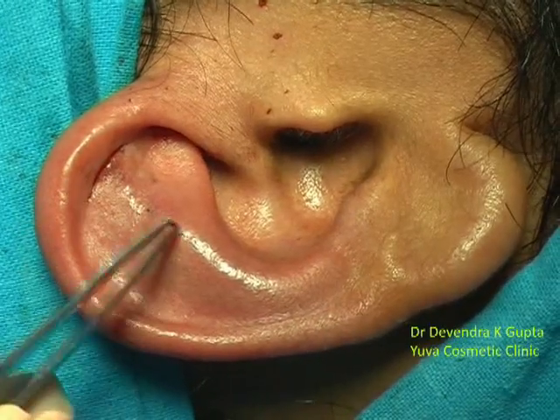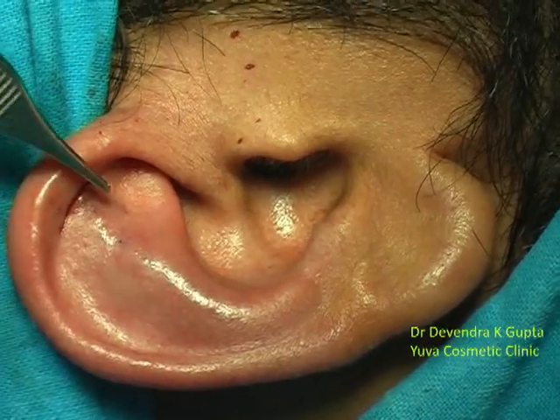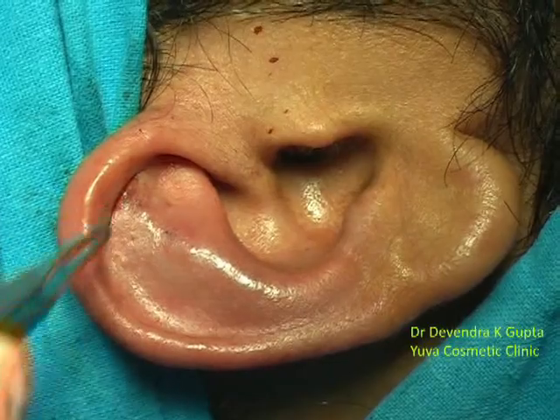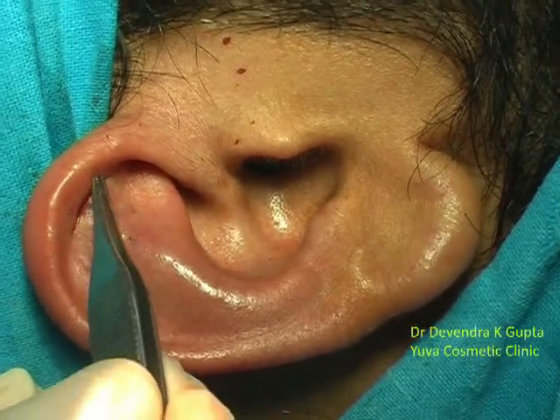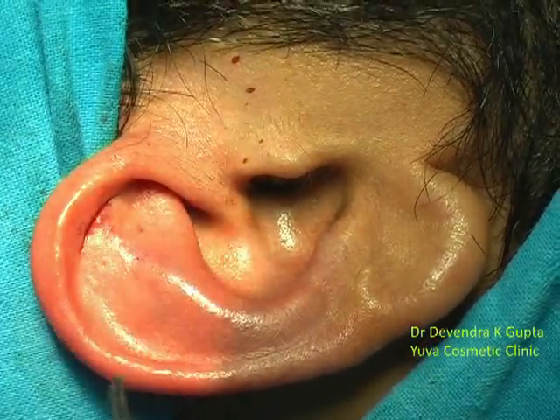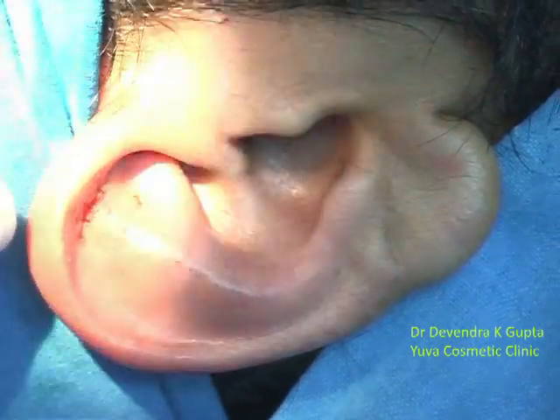We scored the cartilage at the anti-helix border and put two stitches of 5-0 prolene by making a small one-millimeter hole on the anterior aspect and fixed it. The superior-most stitch was placed from the wound side, gently curving the anti-helix border. The small incision — about three-quarters of a centimeter — is hidden inside the helical rim, with gentle curvature and mild bending of the pinna in the backward direction. Only three stitches were placed here.